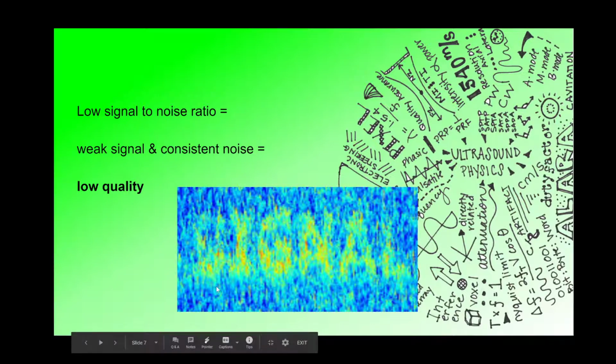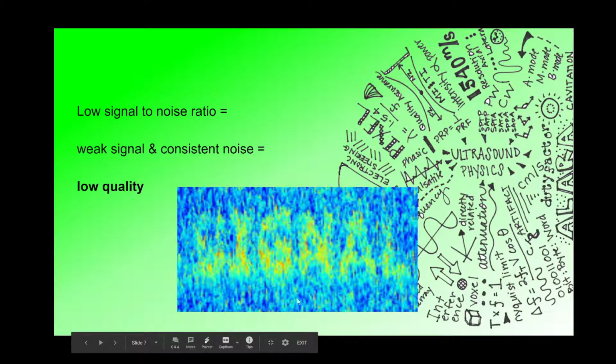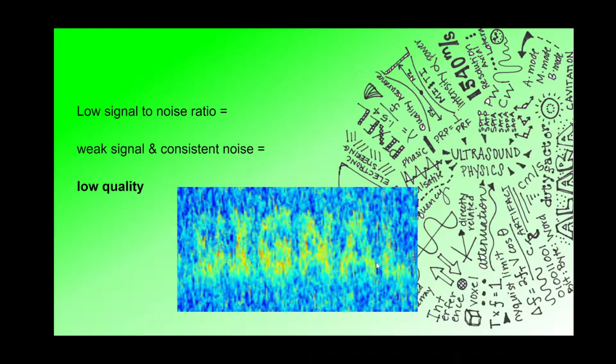I really like this picture because it shows we can still read that this is signal. You'll still be able to tell that you're looking at a liver or the mitral valve, but it's going to be faded into the rest of the picture. This is a low quality picture.